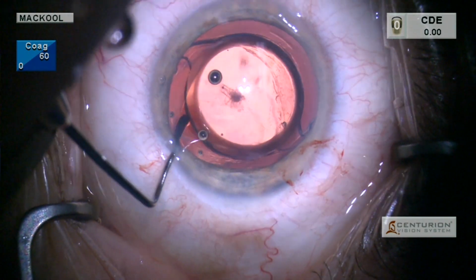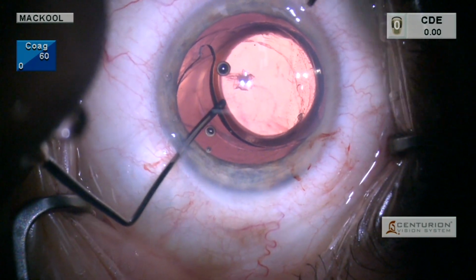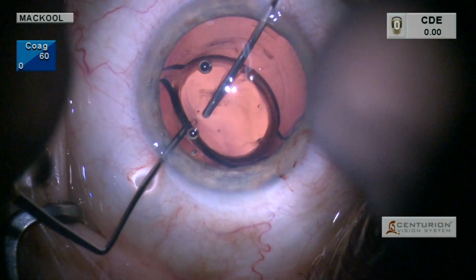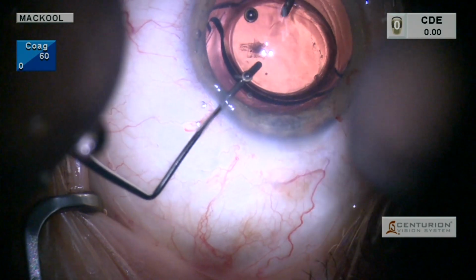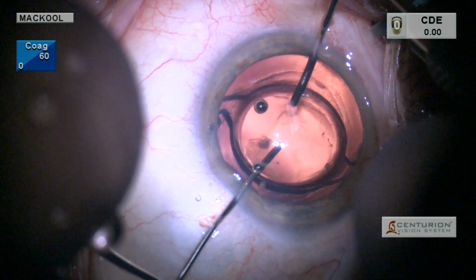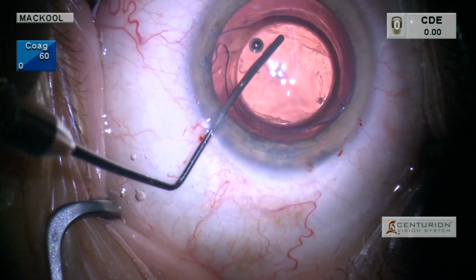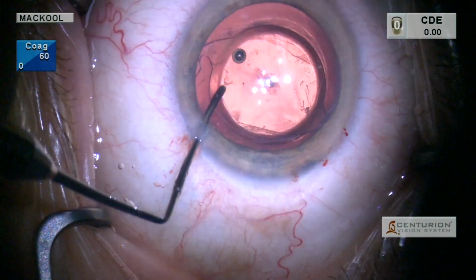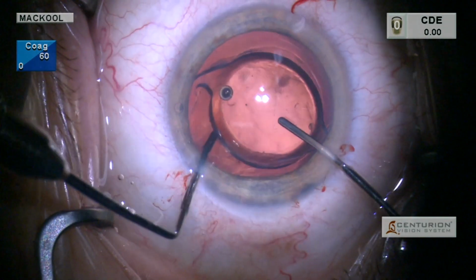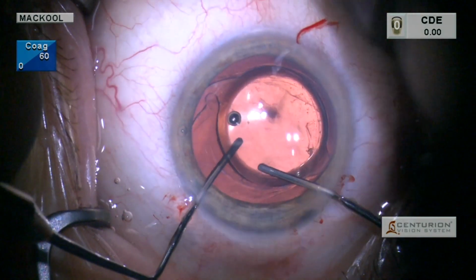So now from the other side, kind of tire ironing around and getting separation between anterior capsule and optic. So now with the spatula, you can see the anterior capsule there being displaced a bit on one side, and now on the other side, similarly, I'm trying to push the optic over the inferior, if you will, spatula and prolapse that optic.